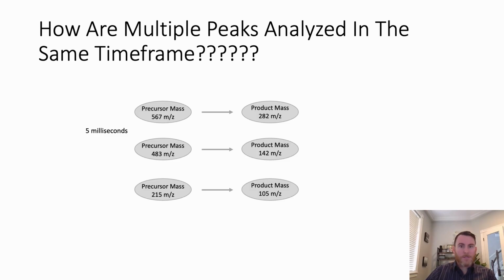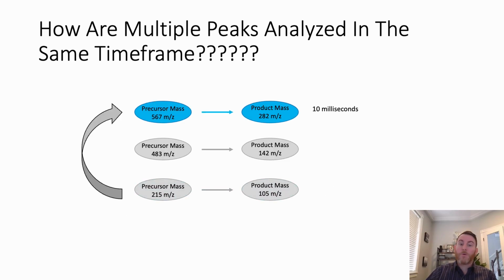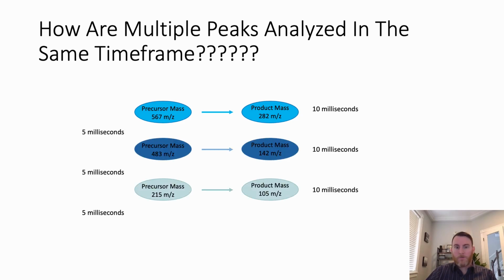It basically turns off its detector and lets all of the ions that were floating around in the space of the triple quad fall out or hit any of the quadrupoles so that you're not counting them. And then the mass spec turns its eyes on again and looks for a different transition for 10 milliseconds. Then closes its eyes, then looks for 10 milliseconds, and then closes its eyes, and it repeats over and over and over again.